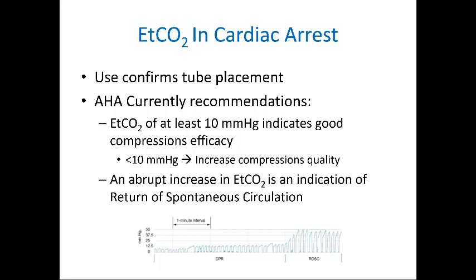Also, trending over time, which is present in the waveform at the bottom of the screen, can show that the return of spontaneous circulation has occurred well before pulses are present in our patients. An abrupt increase in end-tidal CO2 during resuscitation is an indication of return of spontaneous circulation.